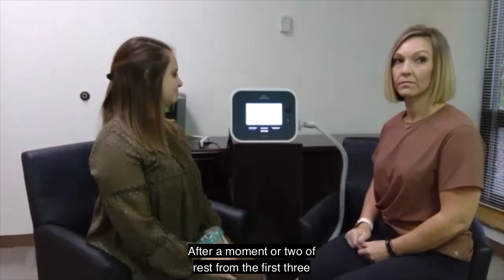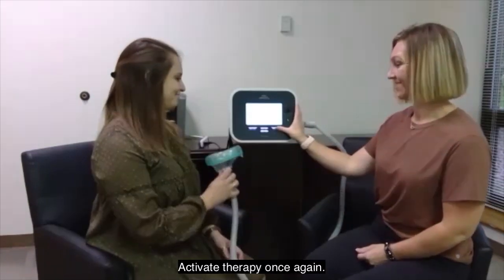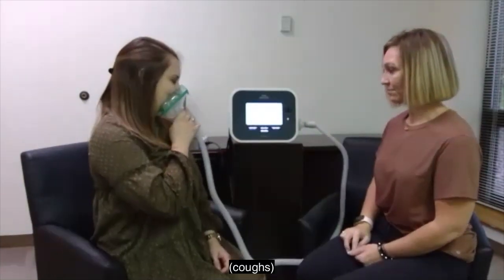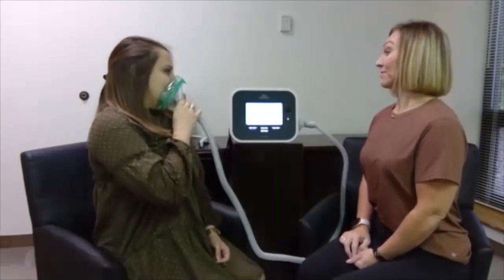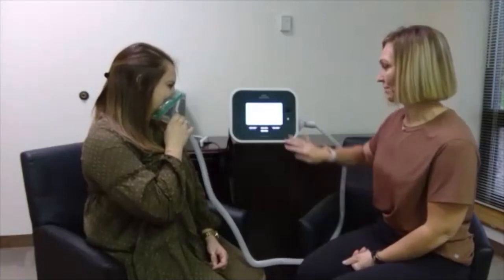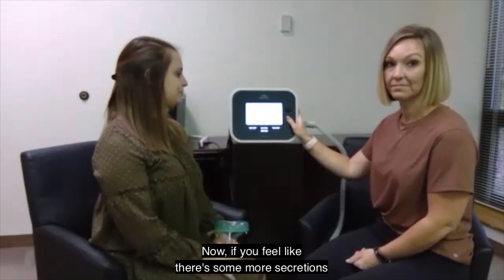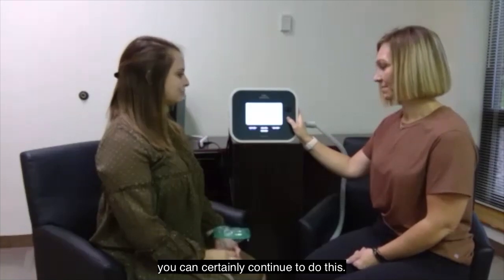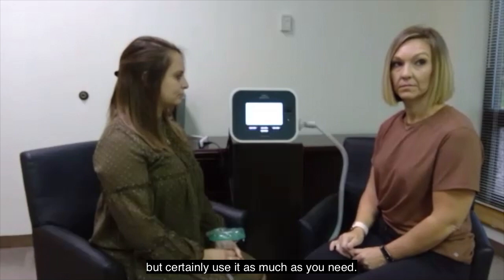After a moment or two of rest from the first three, we go ahead and do the next set. Activate therapy once again — it's the same thing: deep breath in, then remove the mask and suspend therapy. If you feel like there are more secretions still in your airway, you can certainly continue. But we want you to be reasonable — don't overdo it, don't hyperventilate yourself, but certainly use it as much as you need.